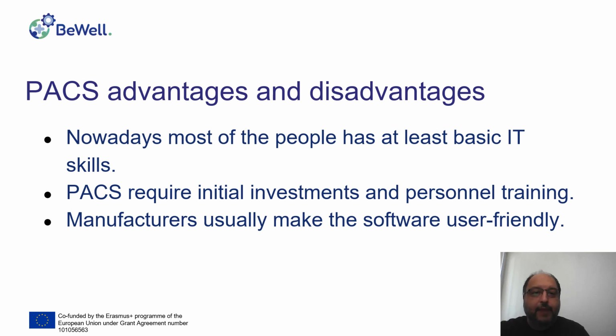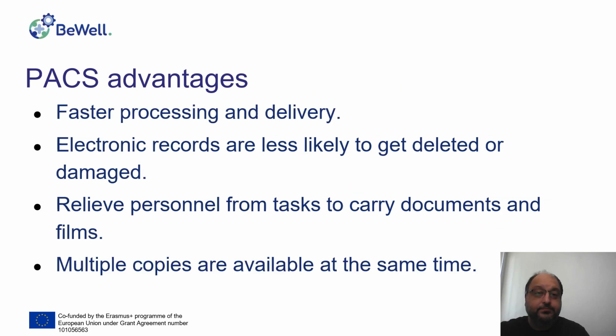But anyway, nowadays systems do not require some very advanced IT skills. They require only very basic IT skills. PACS requires some initial investment, of course, and personal training, but because the manufacturers make this software very easy to use, usually the staff training is not intended for the staff to learn IT skills, but to explore the full capability of the system.